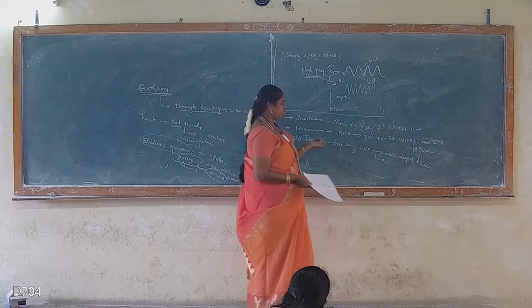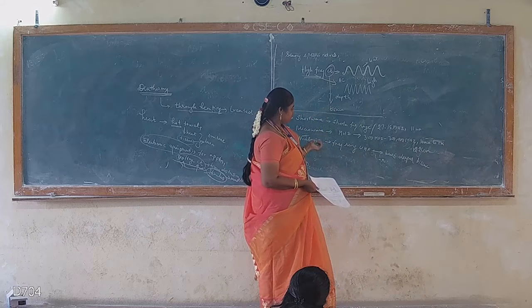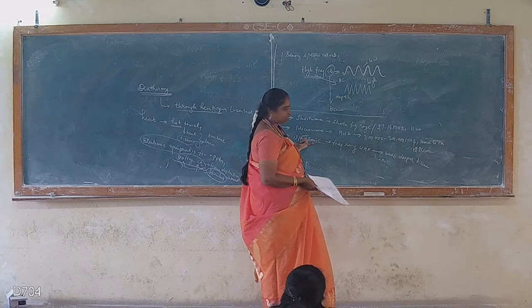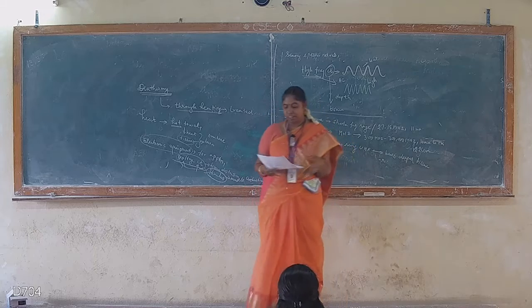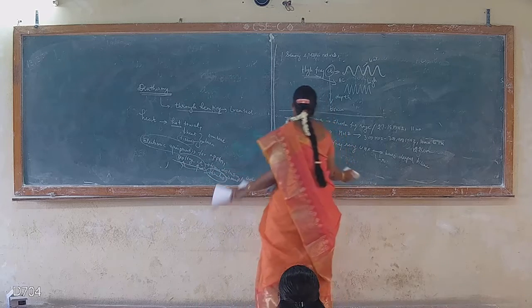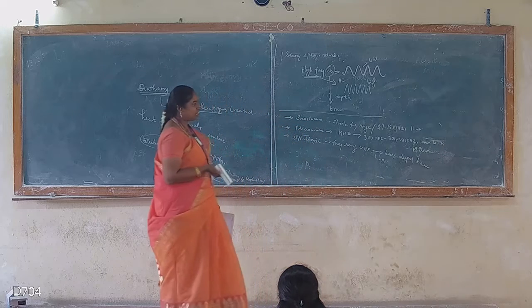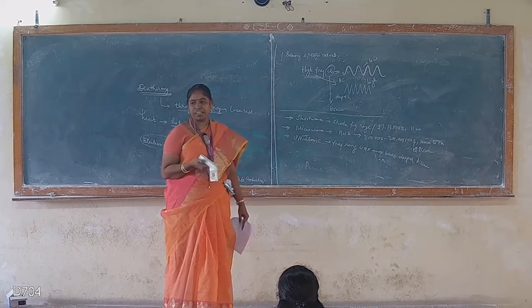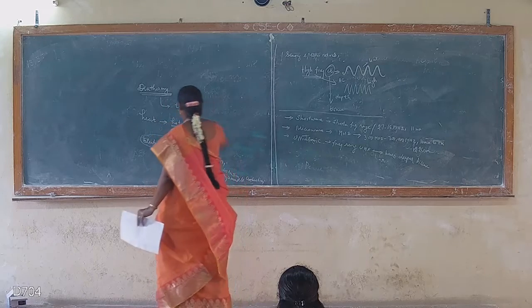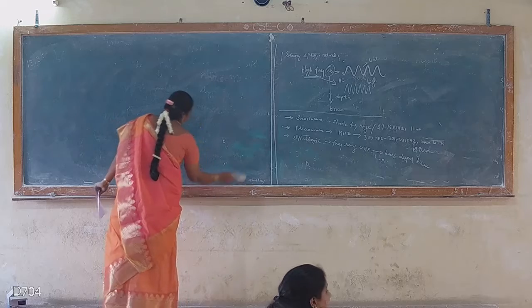Similarly, the ultra high frequency range, if we generate it for treating an area, is known as an ultrasonic diathermy unit. Let us see one by one in detail how a shortwave, microwave or ultrasonic wave can be generated, and how it can be applied to the human tissue for treating a particular area or region. So first, short wave.